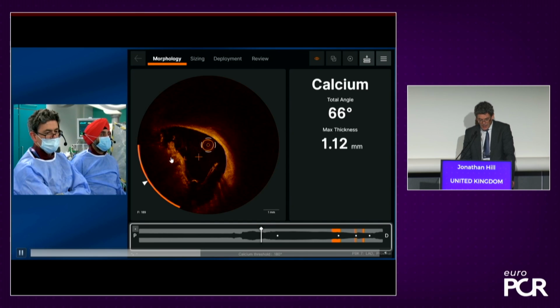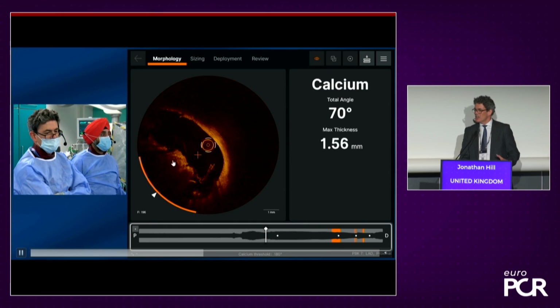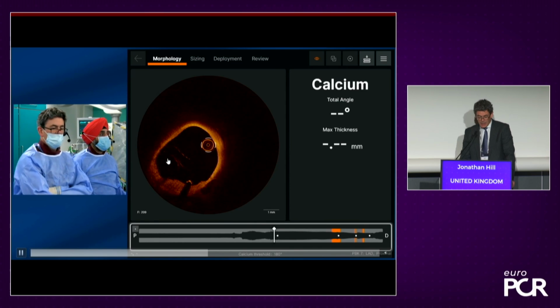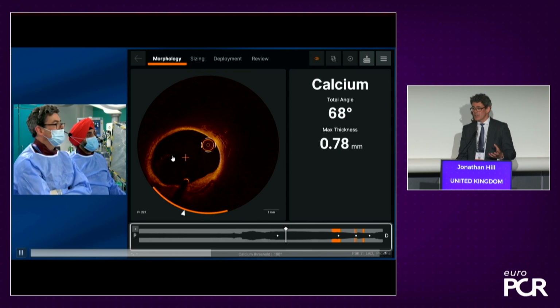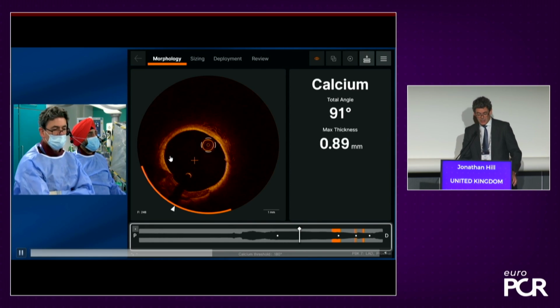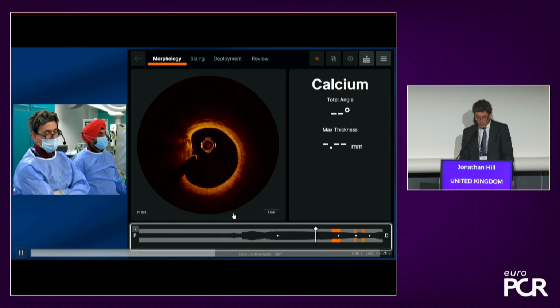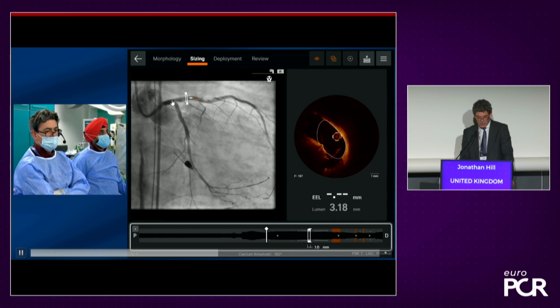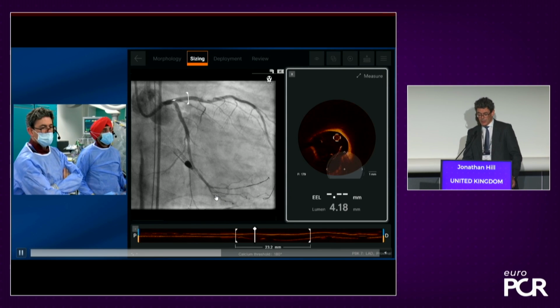But what we're seeing here is this nodule. There are cracks within this nodule. Now, we initially thought that nodular calcium was not modifiable by IVL. But what we're seeing over and over again, when we've applied a lot of shocks to that region, is that you see clear macrofractures, and we know from the histological data that there will also be lots of microfractures. And you can already see within this segment, this ostial segment and this overhang of this nodule from the left main into the circumflex, that you've had substantial luminal gain already.